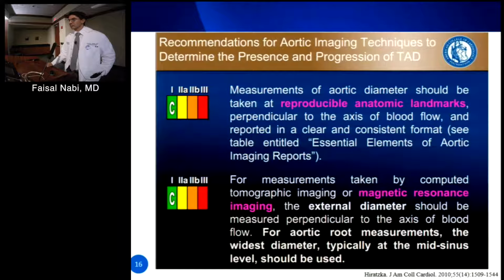It's interesting to raise what the guidelines say. I think it's just the chamber dimension guidelines. No, there are aortic guidelines in 2015. They actually have a nice paragraph saying the committee hoped to resolve these differences but was unable to, and therefore recommends echo continue doing it the way it's done and MRI continue doing it the way it's done. But you're not going to be able to resolve it. In the best situation, you will take away the thickness of the posterior wall.